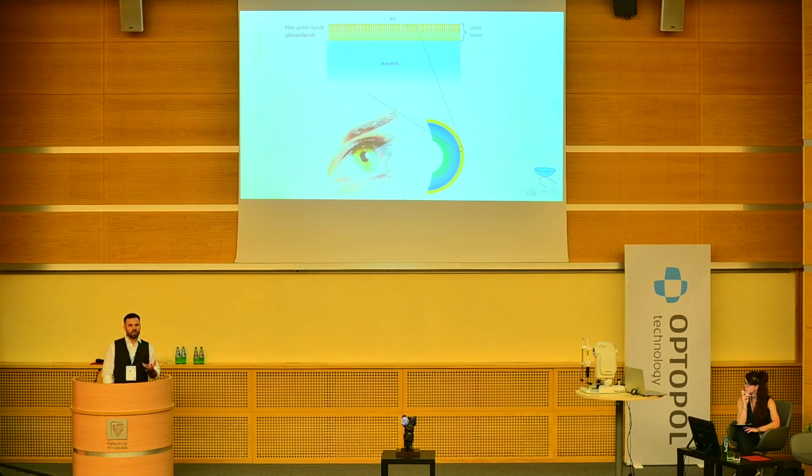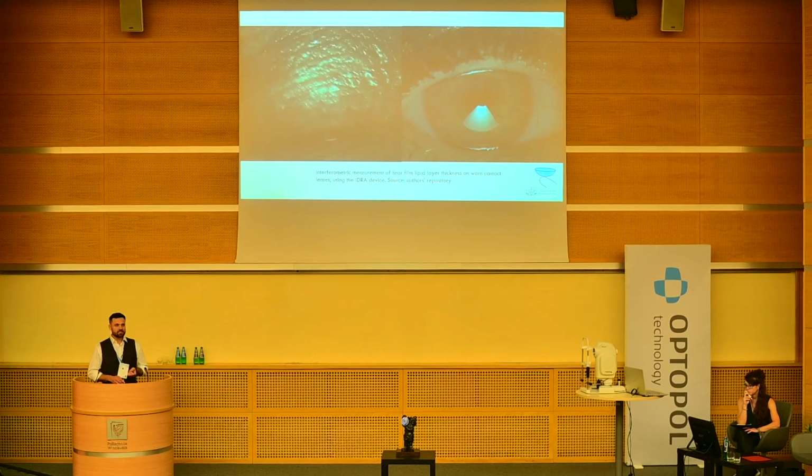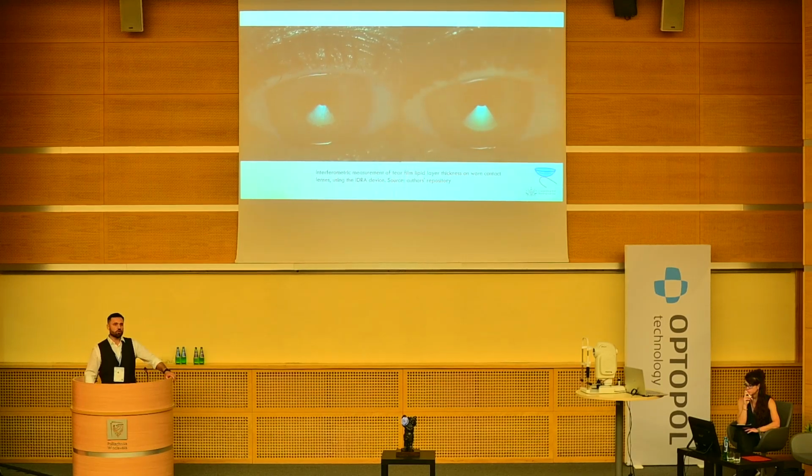From the clinical perspective, we know that lenses can perform totally differently. These images are from our other study, where we used interferometry to look at the tear film on different lens materials.